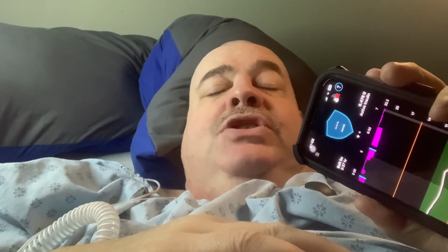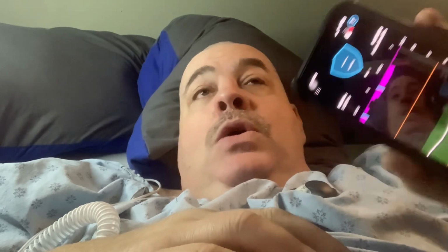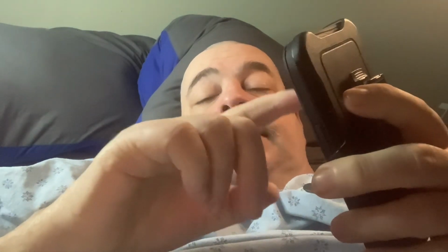People can ask and say, do you know what your blood sugar is? I'm just curious. There's much better ways than sitting there saying, what's your blood sugar? And another nice thing about CGM is my friends have access to it, which means on their phone, they can take a look and say, okay, he's dropping. He's been dropping for a while. And at some point, they will call the care home here. Eventually, the nurses will have my old phone and it'll say where the blood sugar is. And if we need to, they can intervene.